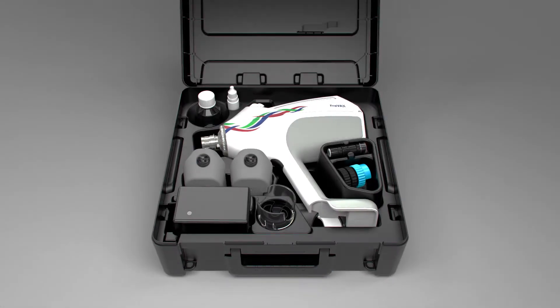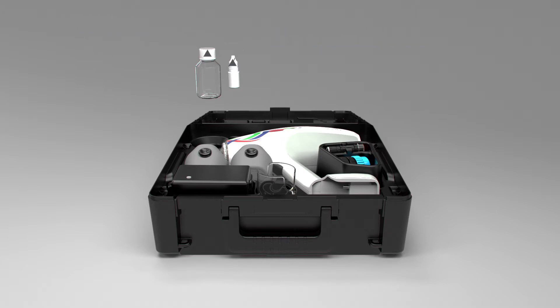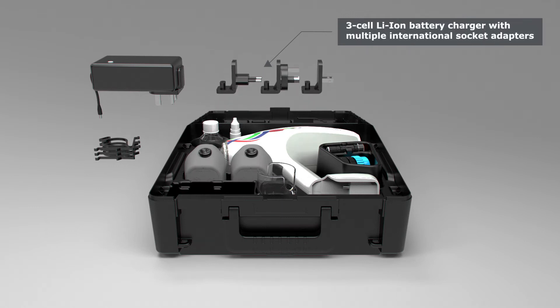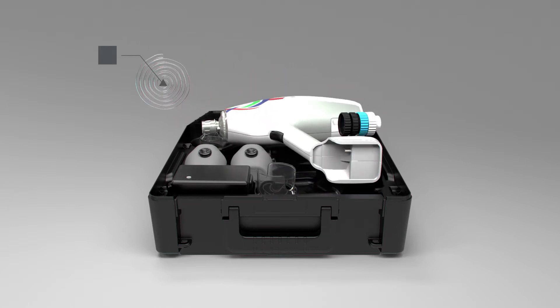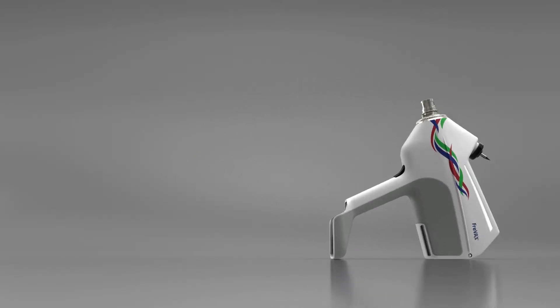Upon receipt of your Freevax, remove the outer carton box and open the case. You'll find a number of accessories supplied with your needle-free device to ensure full flexibility in use, including the bottle holder. Charge the battery before use.